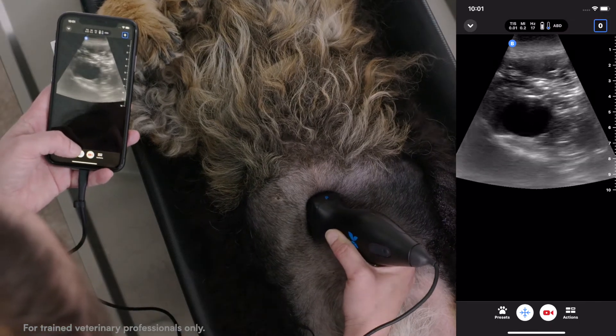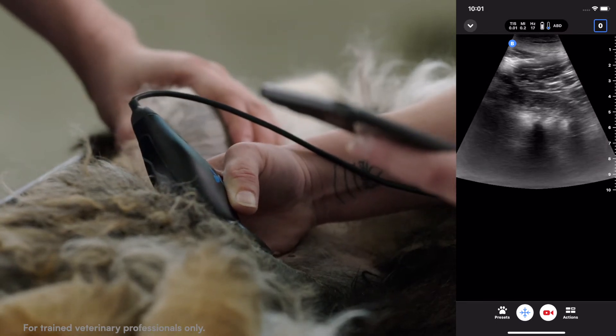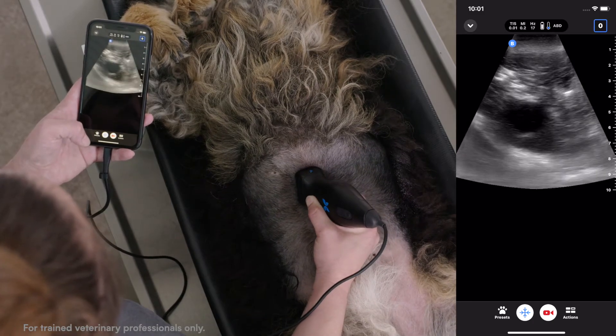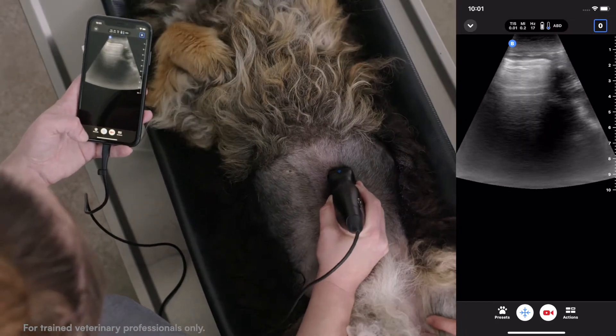As you start panning through to the right side of the abdomen, that will be you moving to the left with your hand motion. You'll fan through all of the right liver until you see those rib shadows, then come back through the right liver and gallbladder, and then fan into the left liver where you might see a gas-filled or ingesta-filled stomach.